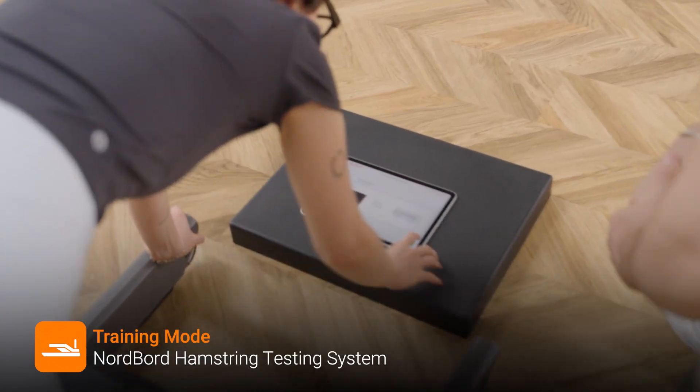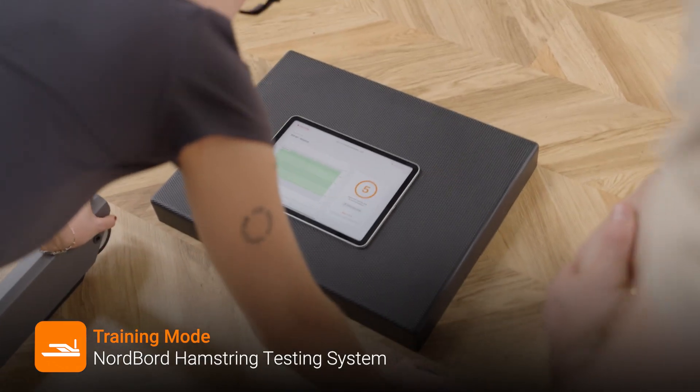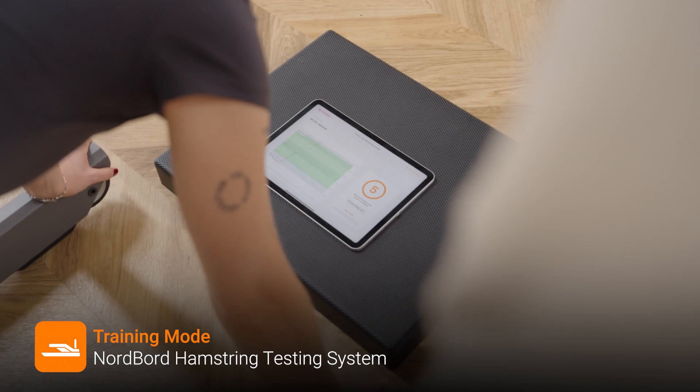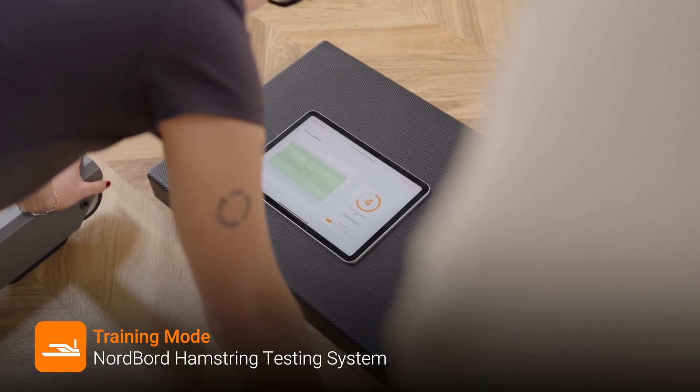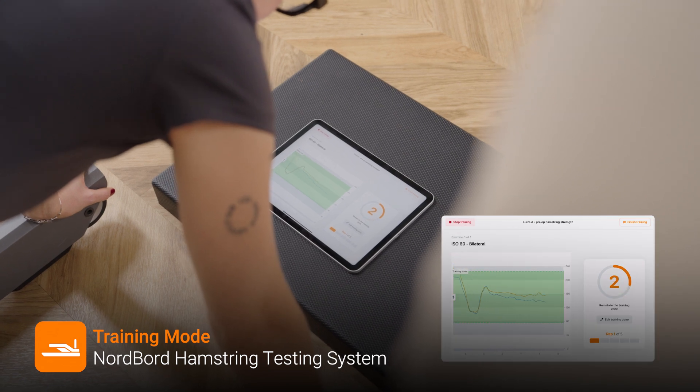Based on your testing results we can use training mode to set a predetermined force threshold within which I want you to train. Aim to keep your force within the green. If that's too easy you can always modify the threshold on the fly.